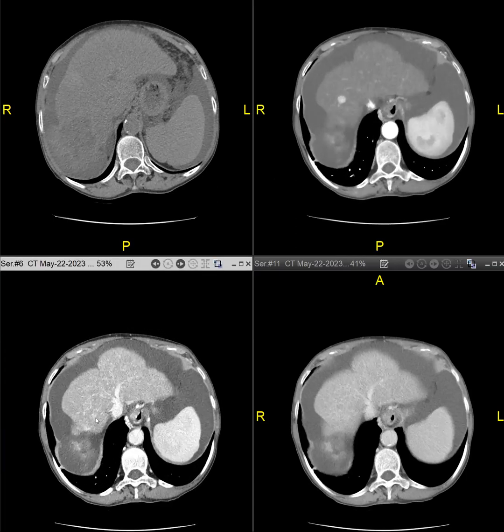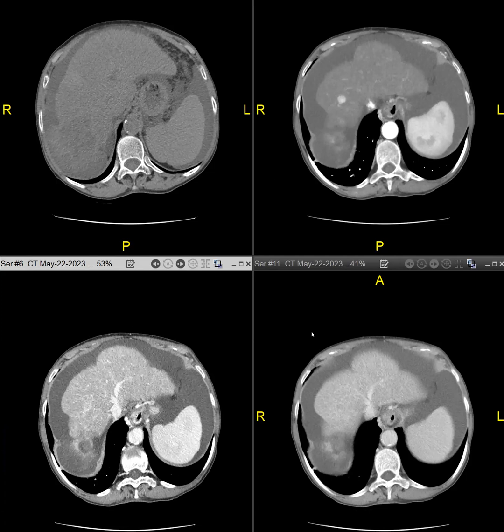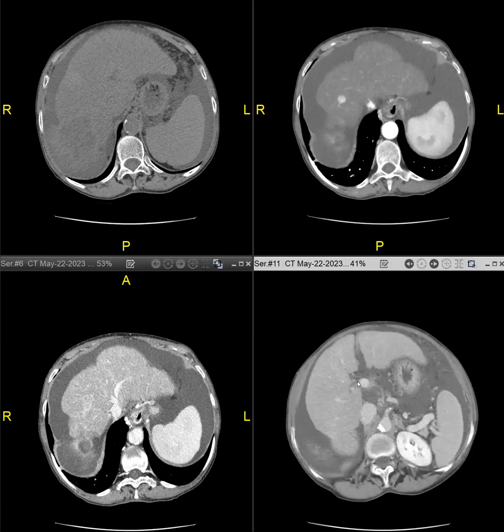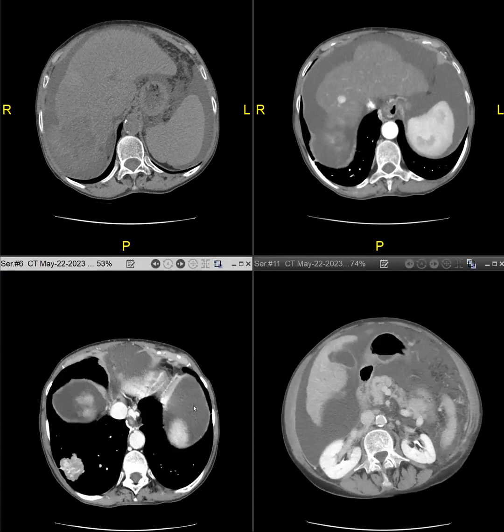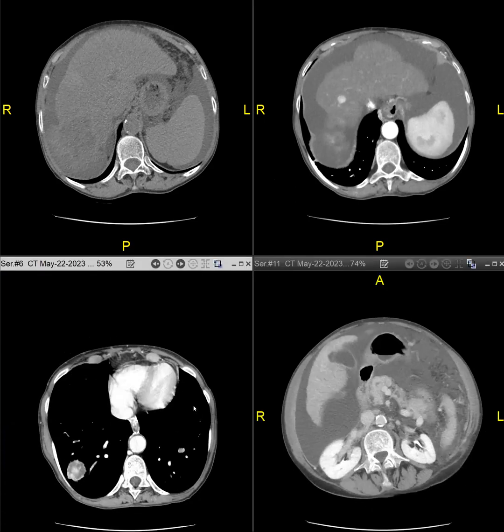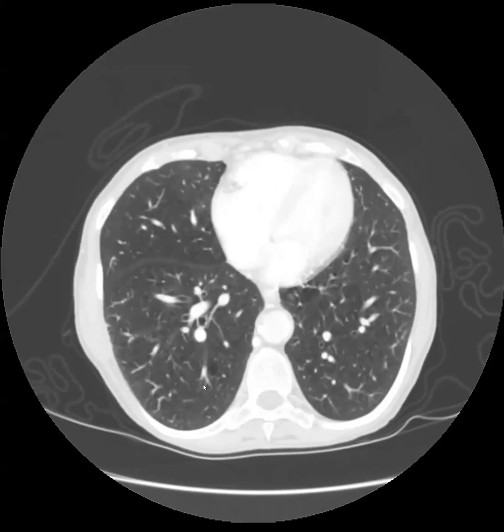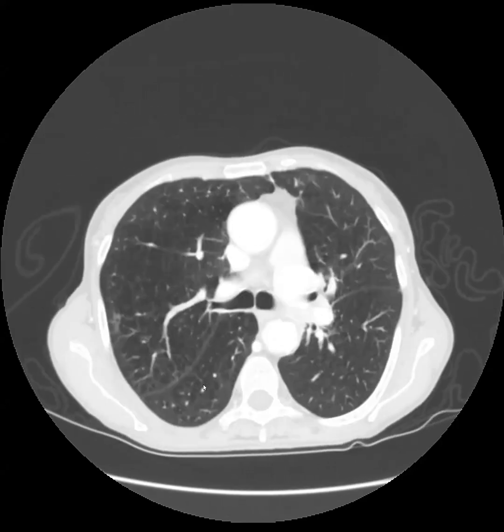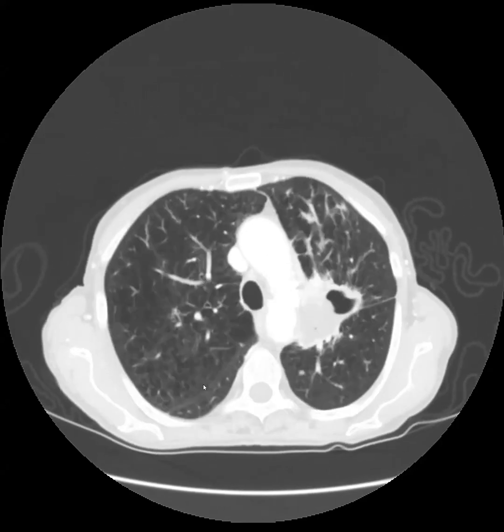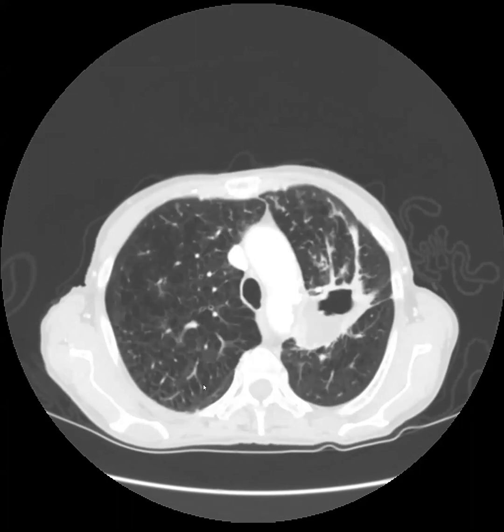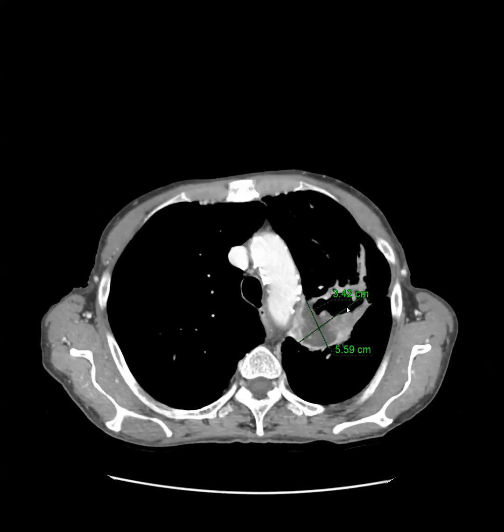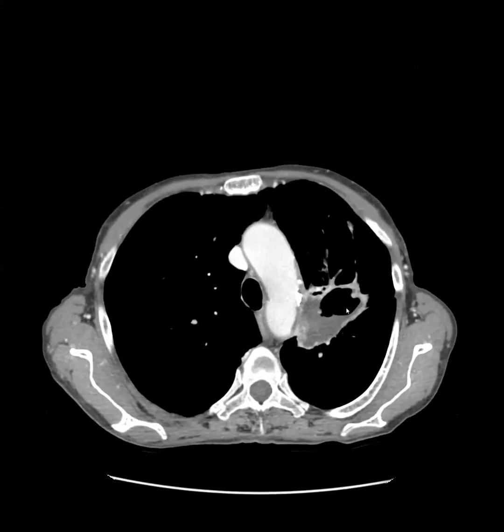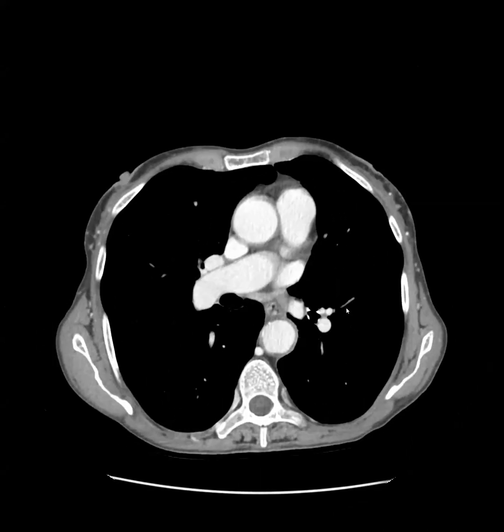And here's a second one, more superior. You can see it also has non-rim APHE and washout, and also meets criteria for LR-5. And looking at the chest, you can see there are just big masses in her lungs.